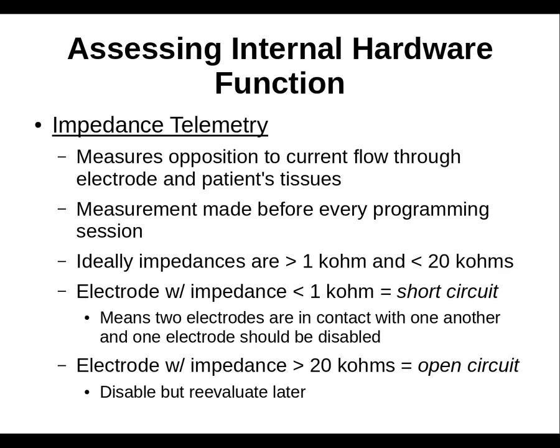And sometimes you can see this in the patient with facial twitching or grimacing, or just kind of discomfort on the face if it's a child. In those cases, it may be needed to just lower the gain on that electrode, or maybe to deactivate it if it cannot be adjusted to make it acceptable.